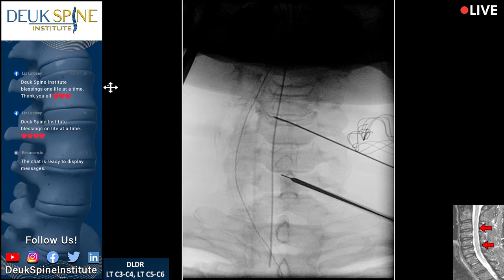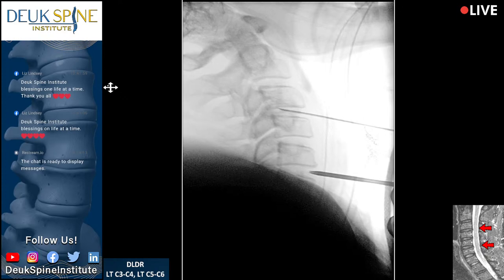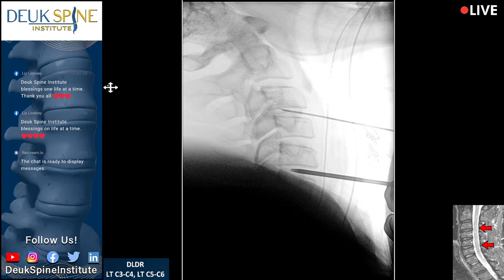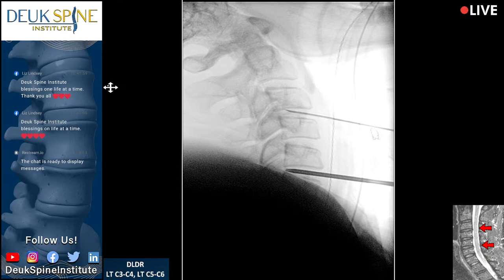In 16 years, we've not had a single surgical complication — it's very safe. I'm trying to push the dilator through the ALL and the anterior annulus; I can't quite do it, so I'm going to gently tap it through. It's not cutting anything — we're literally just gently spreading the fibers. I can feel it advancing with my left hand. I'm at the back of the disc and I can feel the tear right now — I'm inside the tear. It's actually a pretty big tear, bigger than I thought based on the discogram.